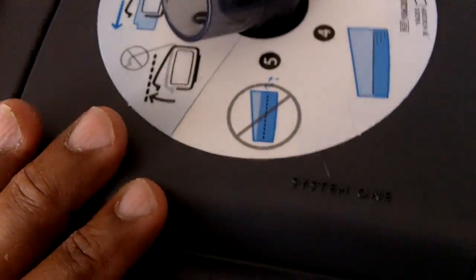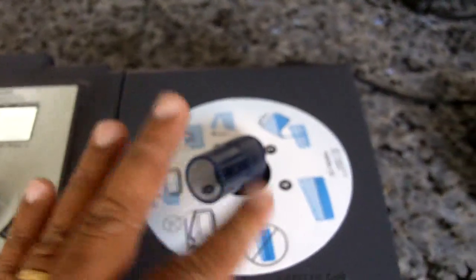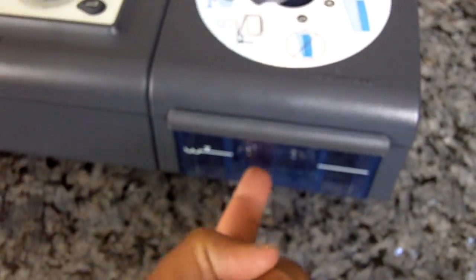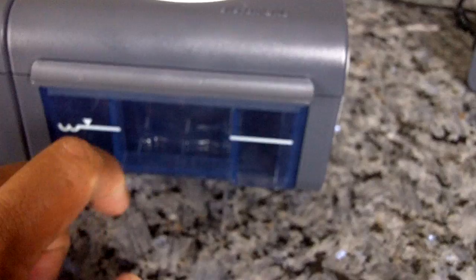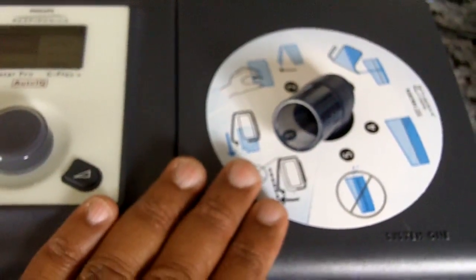In the System One setting, the heater will sense the humidity level or the temperature. I'm getting a little confused exactly what it does. But in essence, it monitors your room temperature and ambient humidity level, and it'll control when this heater will come on and shut off. Many people, especially people who've been using CPAP for many, many years, hate the System One feature because it feels too dry. You're not getting enough moisture. This will override it and you will get a lot of moisture, okay?